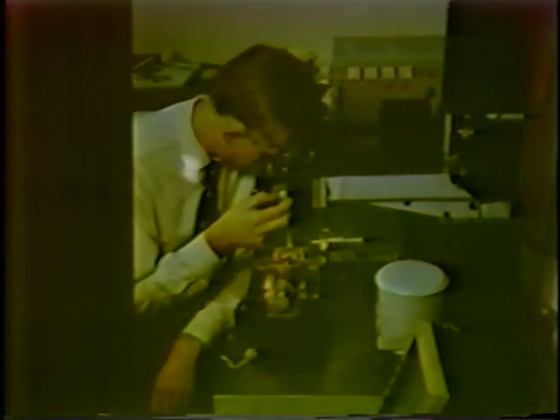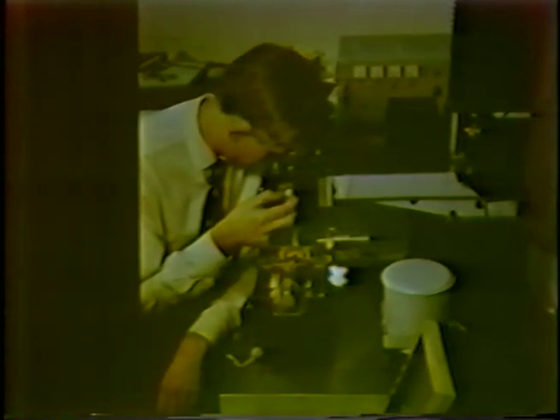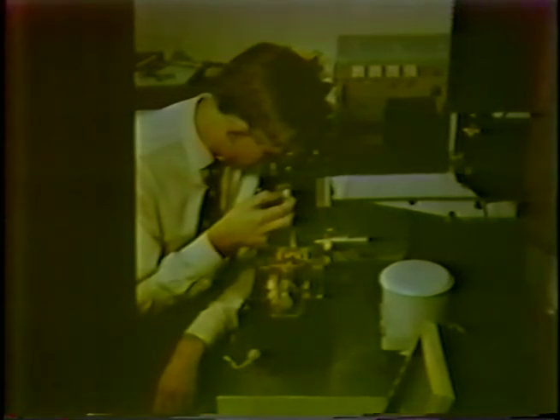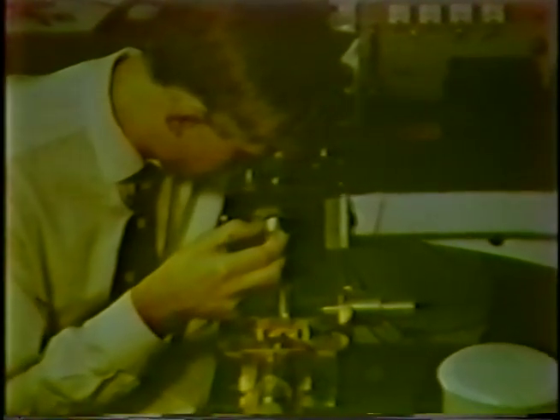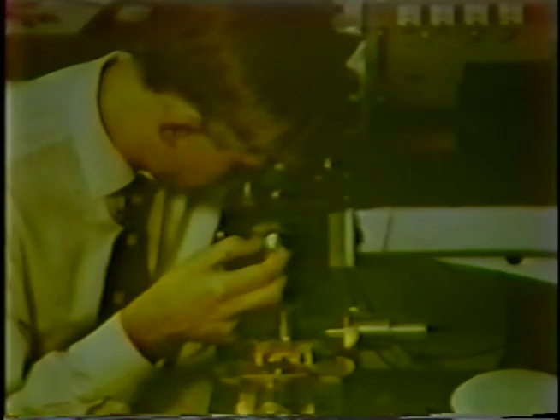Now, I believe that the tandem scanning reflected light microscope configuration is a very useful one because it gives a real-time image, and I want to give you an example here of just how fast this frame speed can be. This is my colleague Tim Watson, who's a dentist, who's using the microscope here to watch teeth being drilled by a very high-speed drill. These drills rotate at 500,000 revs per minute, and he's configured a stage here where he can look at the end of a dentist's drill, watch it moving into a tooth, and watch the damage that's happening inside the tooth structure ahead of the point that it's happening. This is recorded on a videotape and analyzed on slow playback.